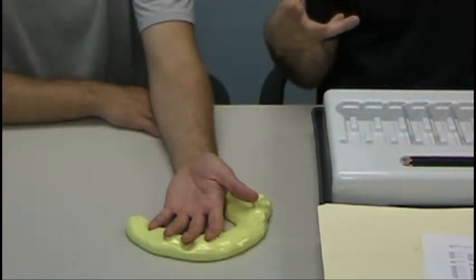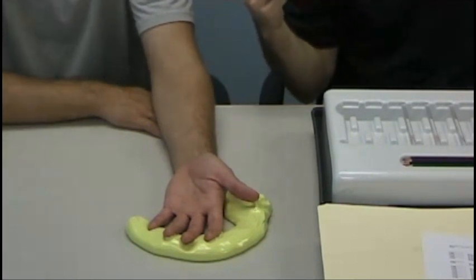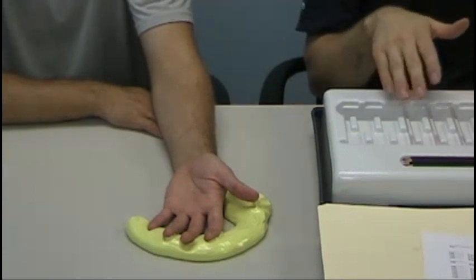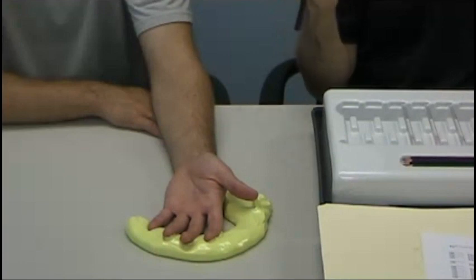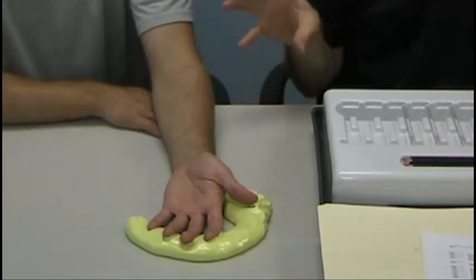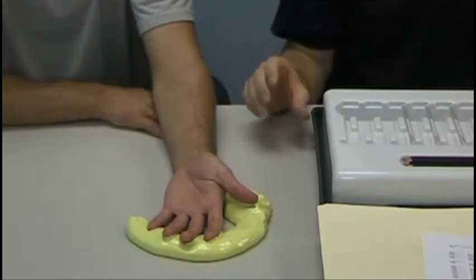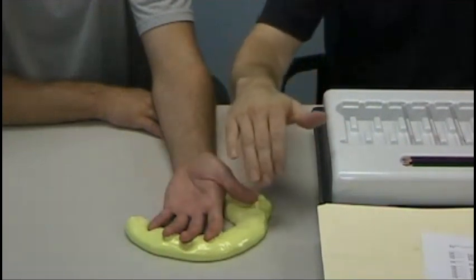When doing this, you want to avoid extraneous movements. Avoid anything like writing something down between applications or putting your filaments back. That would cue the patient that the test is changing or that they got it or didn't get it. You want to keep your patient in the dark with this one. Apply these in random order on the finger so they don't know what finger is next.